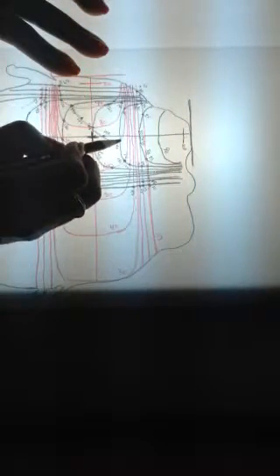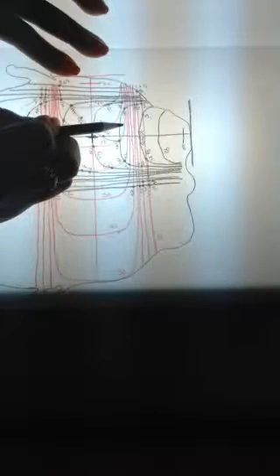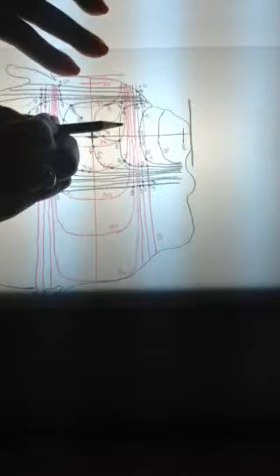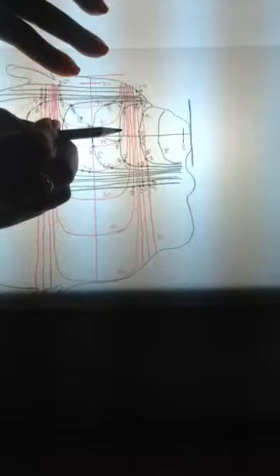Now, does this point connect to that 140? Well, that would mean that there would have to be values between here and there that are also equivalent to 140. So we could look and see if we could have 70 something plus from the AP beam and 70 something plus from the right lateral beam equal 140.